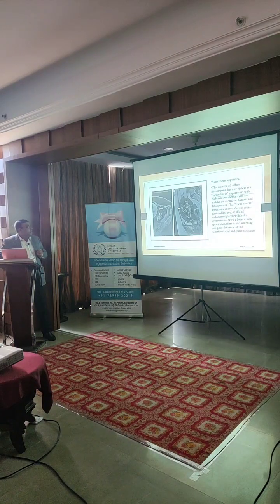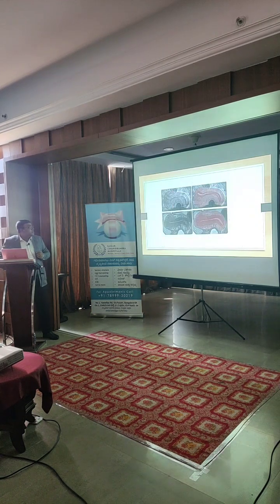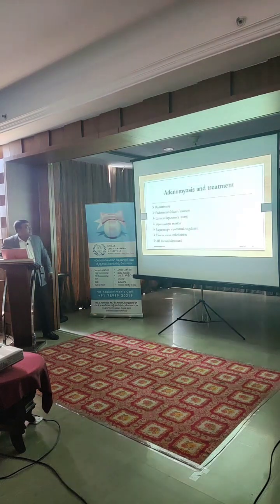This is an image of generalized adenomyosis. The entire uterus is involved with cystic adenomyosis. And then this is the evaluation of the junctional zone. So basically this is the increase in the junctional zone when you have a patient with adenomyosis.